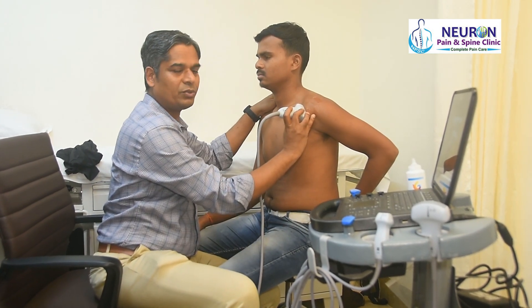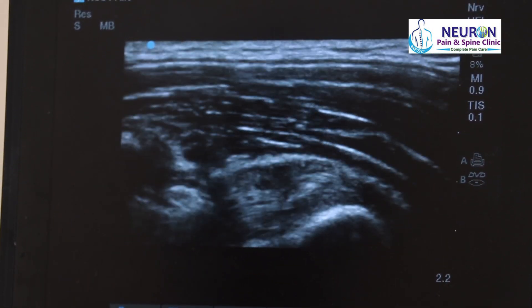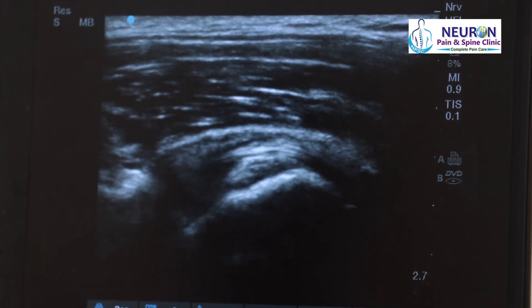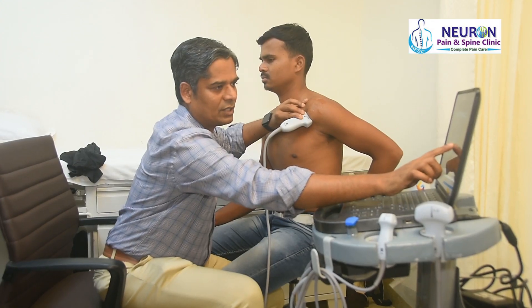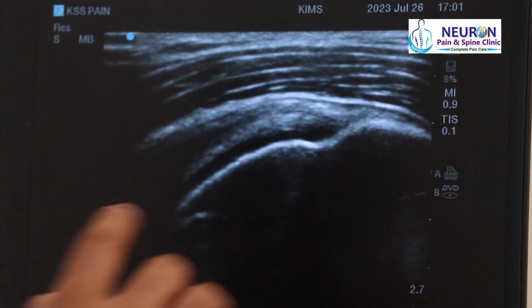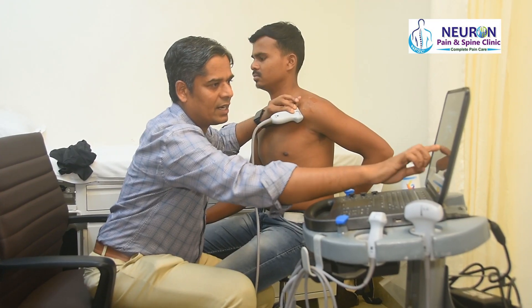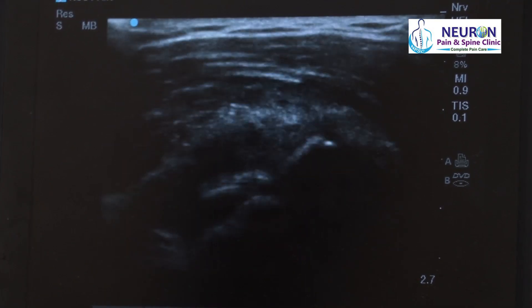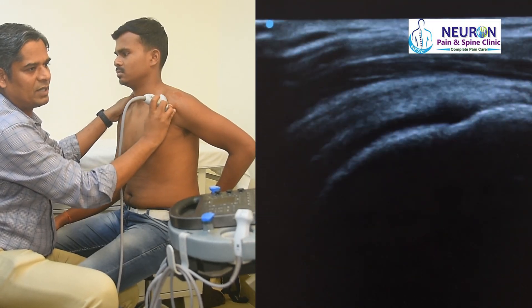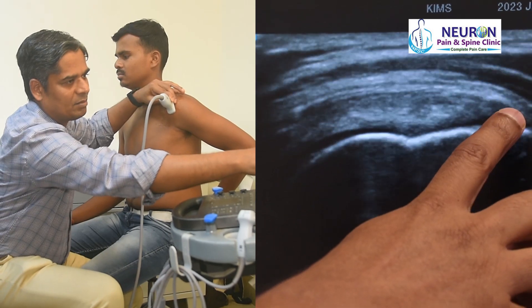To confirm that is the supraspinatus tendon, I slide the probe slightly anterior — as I go anterior, one can see the biceps tendon going in the intertubercular sulcus. I then slowly scan posteriorly from that point, and what you start to see is the supraspinatus tendon with a beak-like appearance. This is the insertional component with hyperechoic fibers and a fibrillar nice supraspinatus tendon.